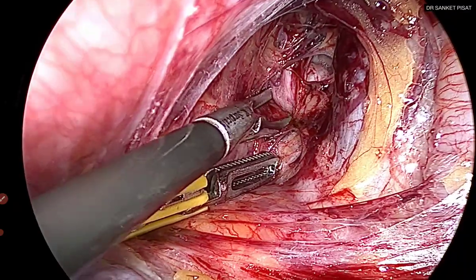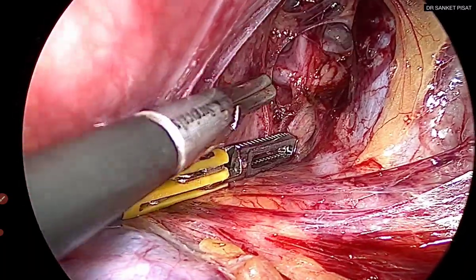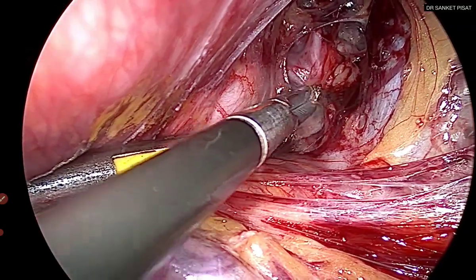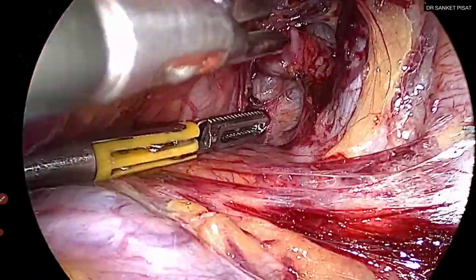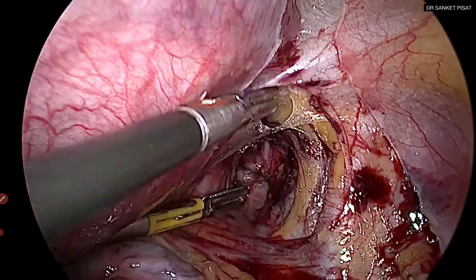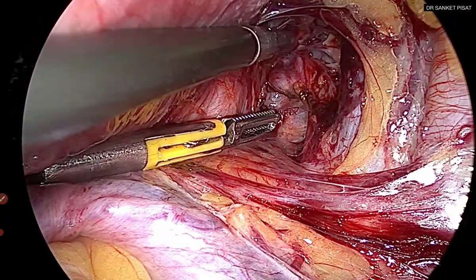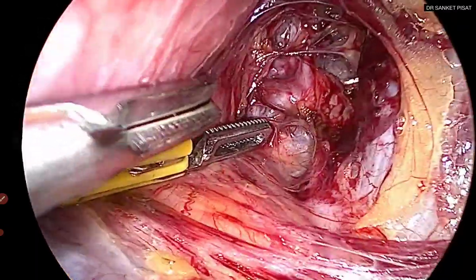I have found the uterine artery and am now trying to skeletonize it. It is very important to remember that the superficial uterine vein lies just below the uterine artery. When doing this step, use a slightly curved instrument — here I am using the curved bipolar vessel sealer — and remain over the surface of the artery. I am coagulating and cutting just around the vessel, not trying to dig deep below it because the vein will be there. If access is restricted, cut more areolar tissue to gain access, but do not struggle too much — one false movement can induce bleeding.